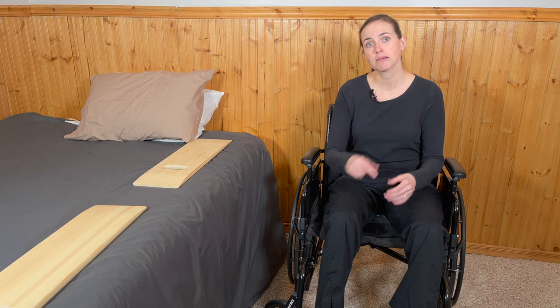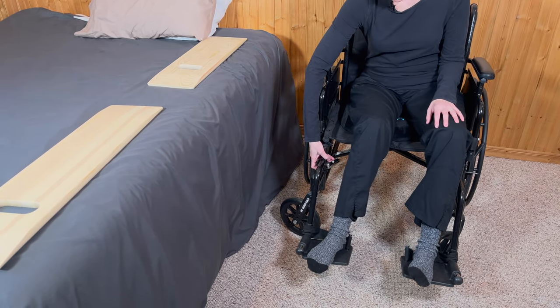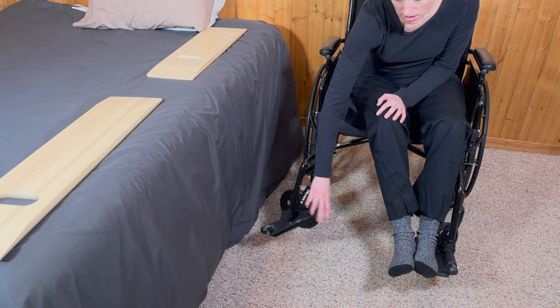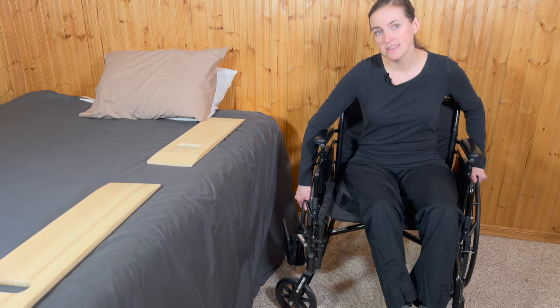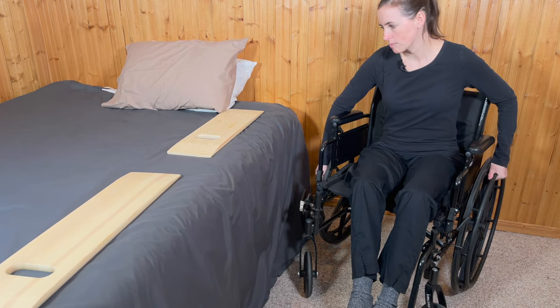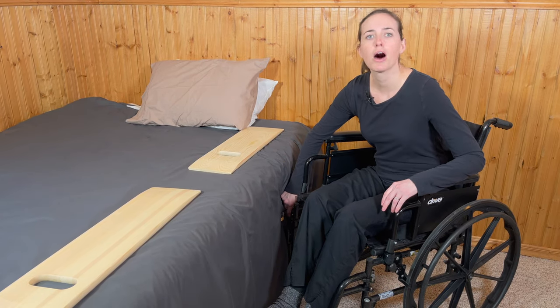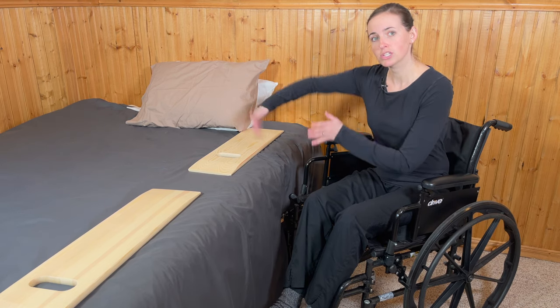First, I have to get my leg rests out of the way. Most leg rests have a swing-away technique — there's a little silver piece you press on that allows the leg rest to swing out of the way. Place your foot on the leg rest away from the bed, flip the footrest up, and swing it back. Make sure your wheels are unlocked, then approach the bed. The goal angle is about 45 degrees between the bed and the wheelchair. Get yourself as close to the edge of the bed as possible — the leg rests can also come off completely if you need another inch closer.